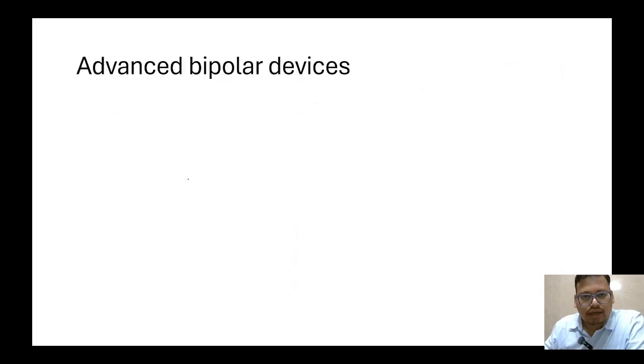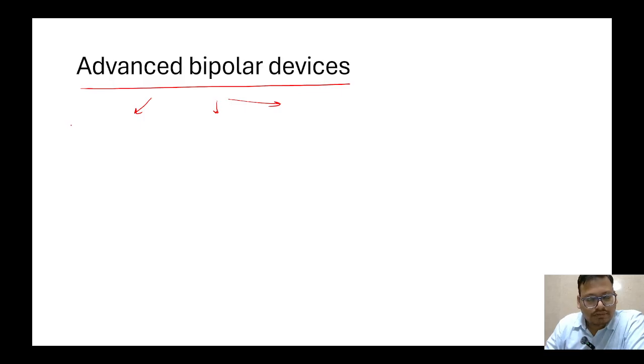Next, we have advanced bipolar devices to manage this. In advanced bipolar devices we have three concepts. One is the thermofusion technique. Another is the ultrasonic technique.